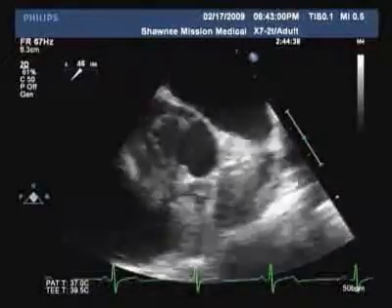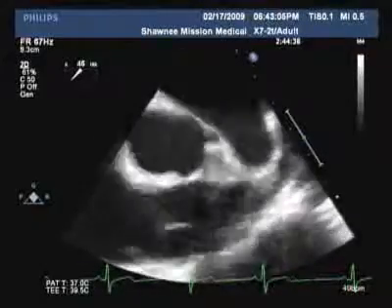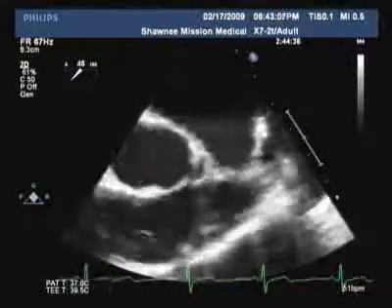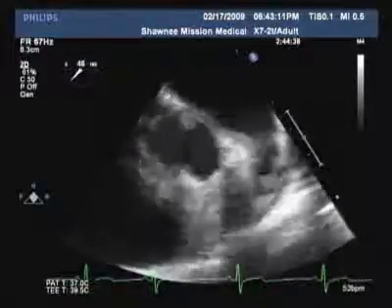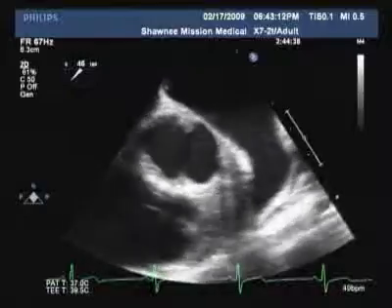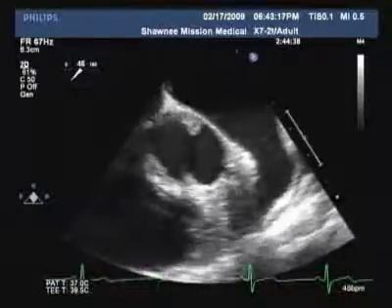And it becomes important because a lot of people have a rhythm called atrial fibrillation. And when people have atrial fibrillation, you can see how that little crescent structure seems to squeeze and go in and out. It's normal with this patient, but in patients with atrial fibrillation, it becomes kind of where it flutters. It doesn't squeeze well, and it's a place where blood can actually pool.